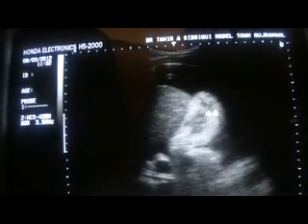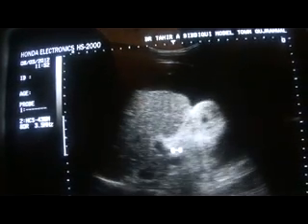At the advanced stage, this is a shrunken liver, surrounded by fluid. Only a shrunken liver can be seen in totality by ultrasound. The rest of the liver cannot be measured in centimeters or millimeters — it is only the shrunken liver that can be measured. This liver measures 132 millimeters, or 13 centimeters, and this area is the shrunken liver.